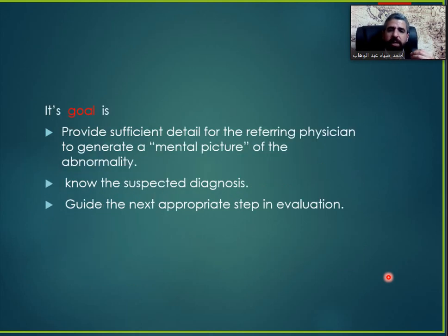So our goal is to provide sufficient details for the referring physician to generate a mental picture. He can imagine what's going on just by reading the report. And he should know the suspected diagnosis and be guided to the appropriate next step in evaluation. We should advise him what's the next step in evaluation of the case or of the patient.